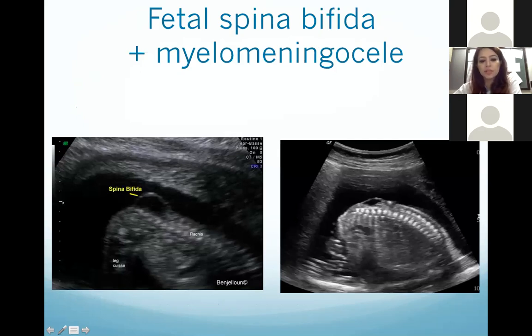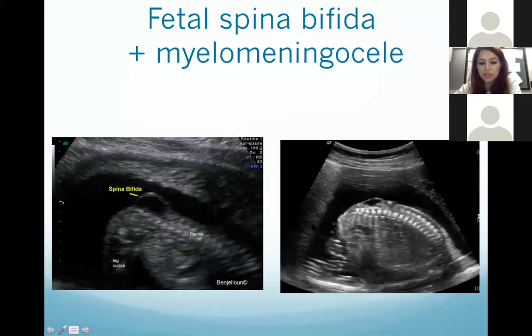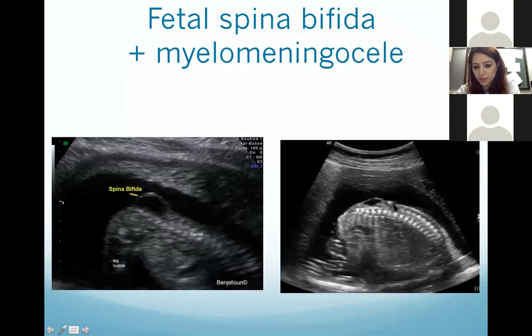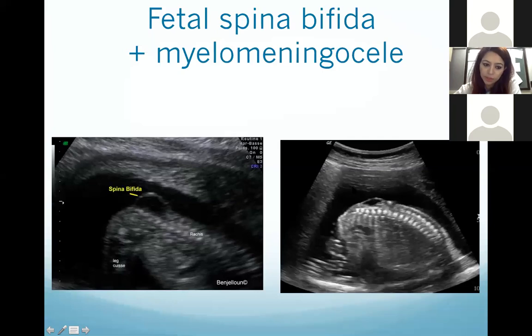Here you can see the fetal spine — the dot pattern you see around the posterior aspect. This is a case of spina bifida: you can see the vertebral bodies and the posterior elements, and in the lumbosacral region the posterior elements are absent with a small cystic area — this is spina bifida with a small myelomeningocele posteriorly.